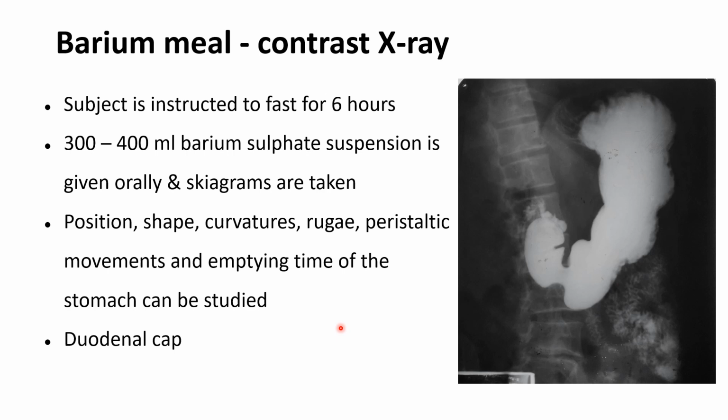And for patients who are taking medicines containing elements of high atomic weight such as calcium, magnesium, bismuth, this medicine should be discontinued at least 3 days prior to the test, because they may adhere to the colon wall in the region of the splenic flexure and cast a confusing shadow during the procedure. So these preparations should be common to all barium studies, and this is the summary of the barium meal where we are visualizing the stomach.